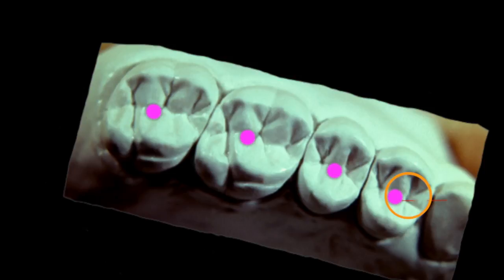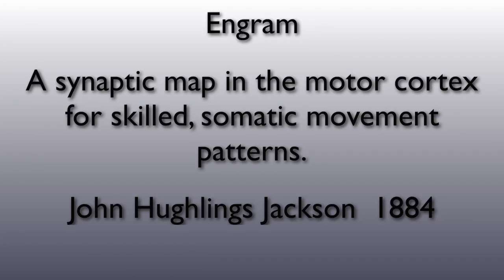Remember the discussion about jawbone geometry. The rest of these fossae most likely have to get progressively deeper as you transition from the second premolar to the second molar. The main problem that one faces in this equilibration process is overcoming the engrams of maximum intercuspation. Here are 8 examples of the engrams which one must contend with.